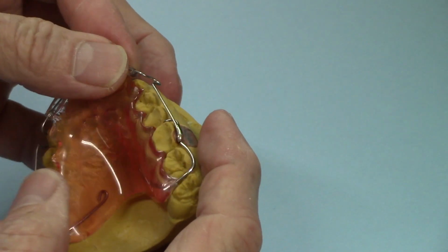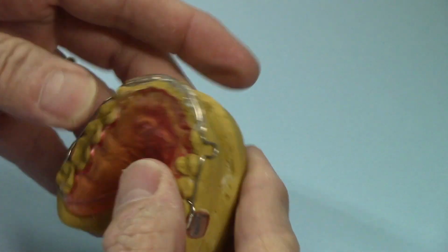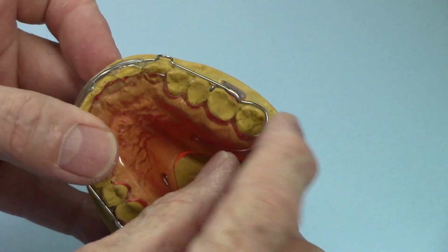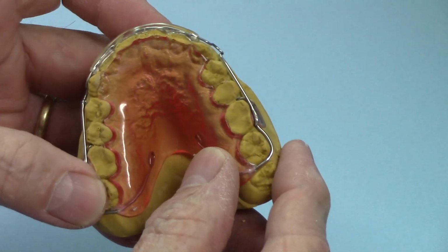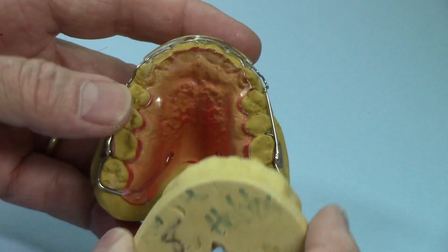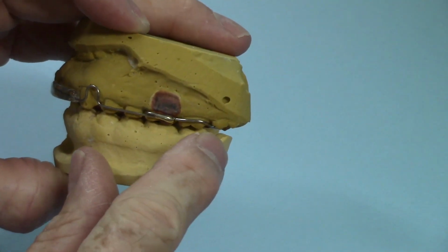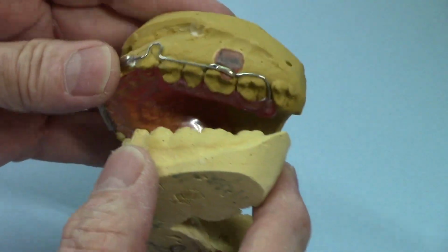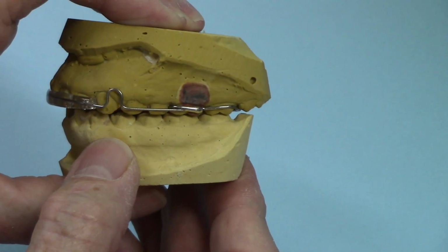So we'll stick it on the model. And it's going to have good retention up here because of the labial acrylic, but the posterior retention is going to be held in place by these circumferential clasps tucked into the embrasures. Pretty good little retainer. Now, I said it didn't cross the occlusal. Well, it does between the second and third molars on this one side. It's only got third molars on that one side. But as you can see, when we put it in occlusion with the opposing, that's a non-issue.